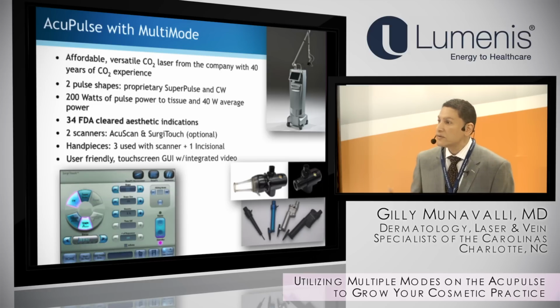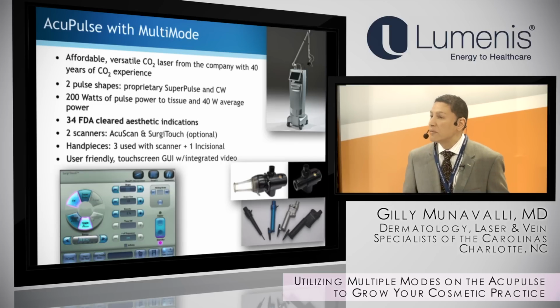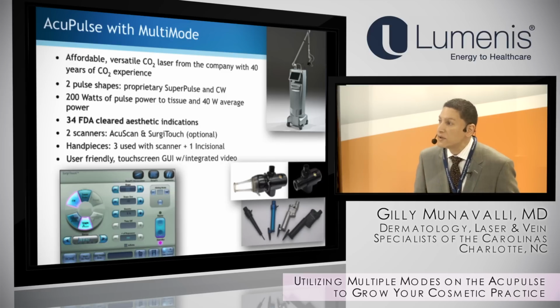So a lot of this is background information. We did some original work with this device probably 4 or 5 years ago, looking at the SuperPulse in comparison to UltraPulse. We found a lot of similarities between the two pulse structures histologically, enough to make me realize that there's not actually that much of a difference at the energy ranges that we use most commonly.